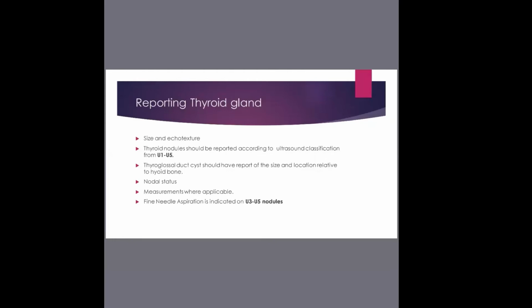But the thyroid gland should be homogeneous. It shouldn't be hypoechoic. It should be normal, like when you see testes, when the parenchyma texture is just homogeneous. And when you have focal hypoechoic areas in the testes, they are concerning. Same thing applies to the thyroid gland.